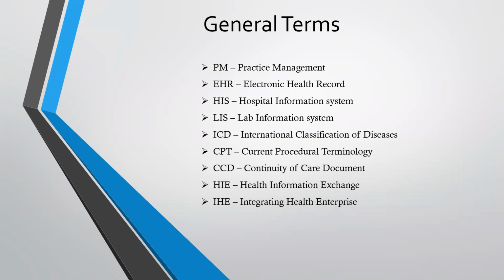We'll take a look at an example CCD down the line. To operate CCDs, we need entities called HIE, which is Health Information Exchange, and IHE. We'll talk more about these three aspects during our last sessions. But mainly, these are the terms that we'll be using in the initial phase of the sessions.